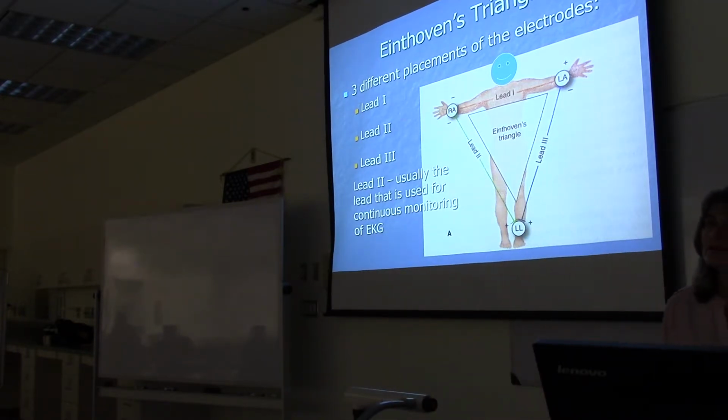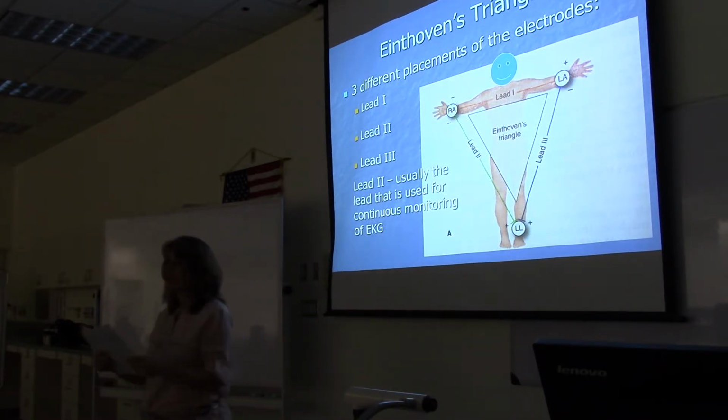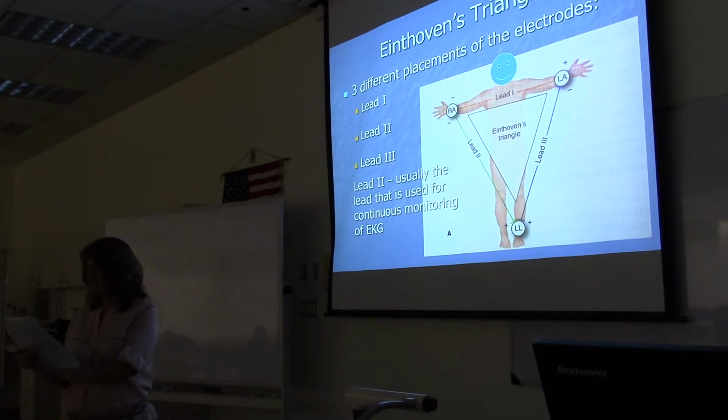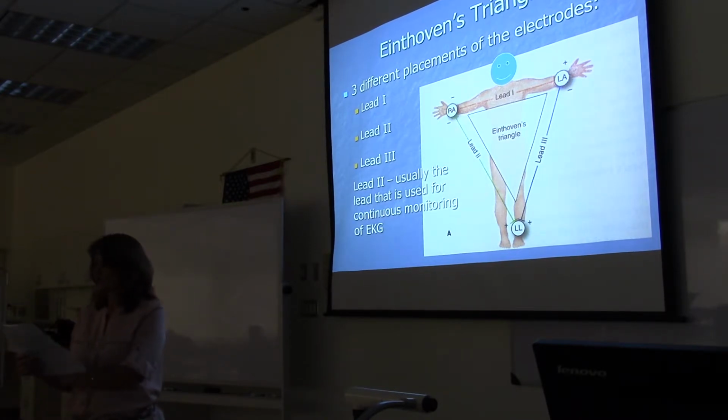Esther, can you repeat that sentence again? I'm sorry, for the different electrodes? Yes. So I have: the electrodes are not moved, but the settings on the EKG machine will change the polarity. Is that the sentence you need? Okay. So what part do you have so far? Just repeat the whole thing. Okay, 'cause I haven't seen it. Electrodes are not moved, but the setting on the EKG machine will change the polarity. Okay, thank you. You're welcome.